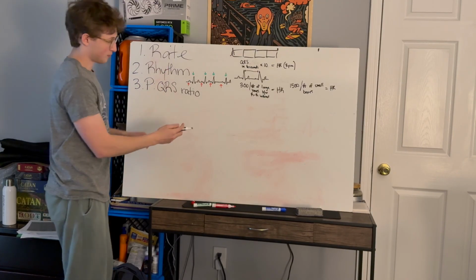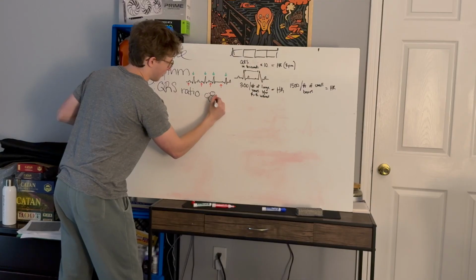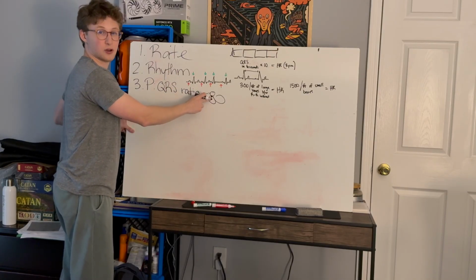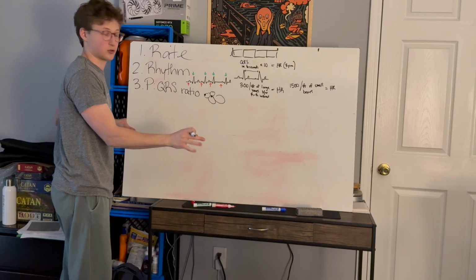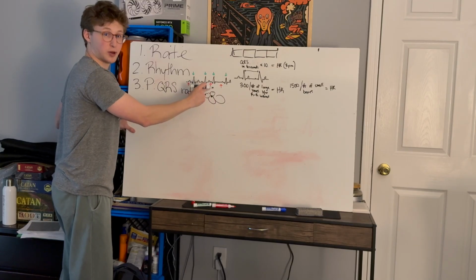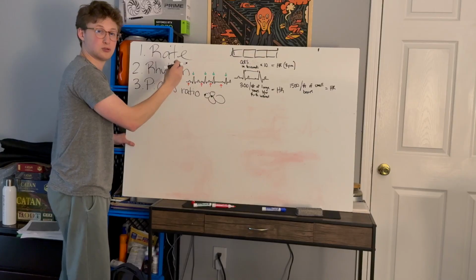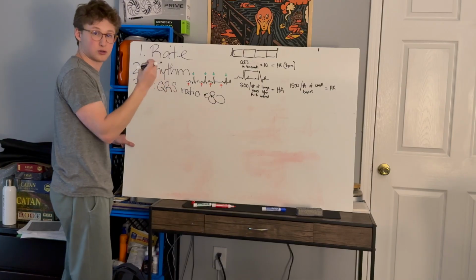In a normal heart, right? SA node fires, sends it through the atria, they contract, it gets to the AV node. AV node holds it on for a second so that the atria can finish contracting, push the rest of the blood into the ventricles. AV node lets it go. It goes down the interventricular septum through the right and left bundle branch, wraps around and through the Purkinje fibers, goes all through the ventricles. They depolarize. That is normal. Every atrial contraction, there should be a following QRS complex, a ventricular depolarization, ventricular contraction.